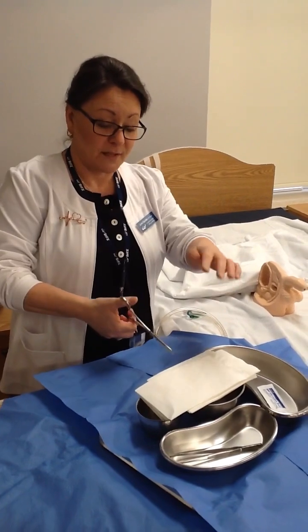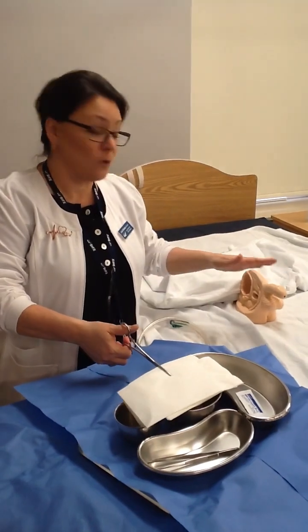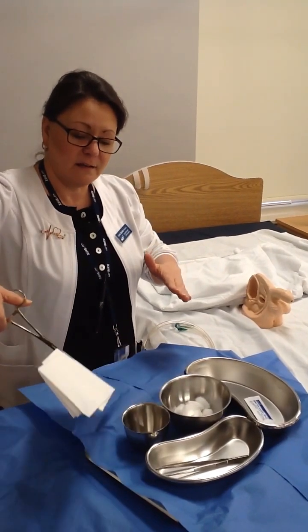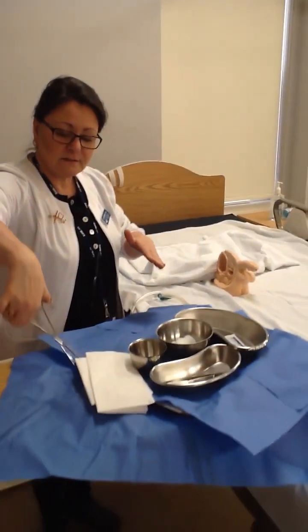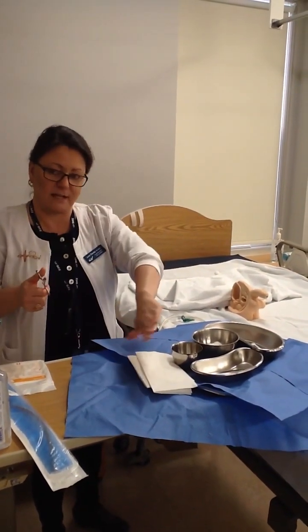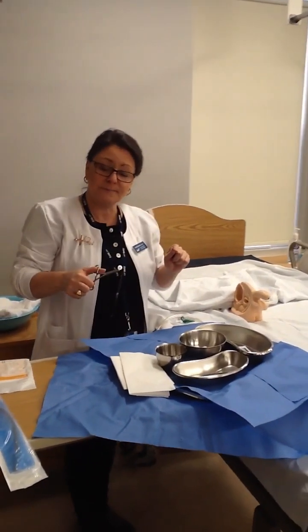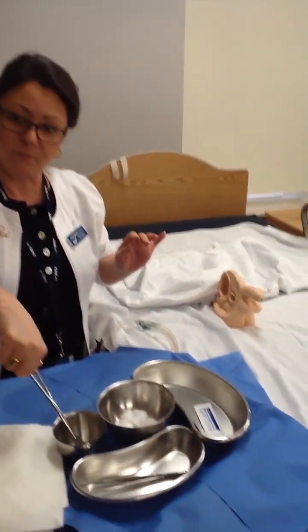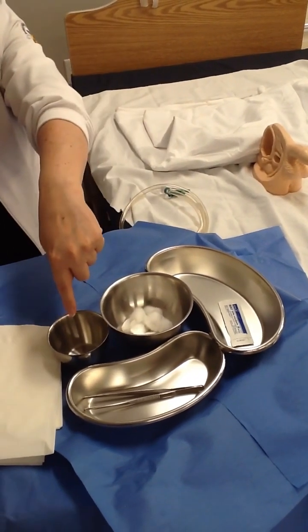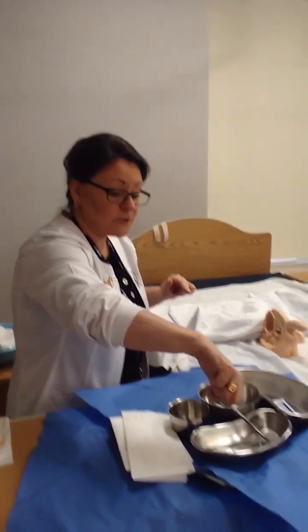I have a set of drapes, 2 of them, to create a second sterile field over here under my genitalia. Once I have everything set up here, I'm going to move that to the side, but well within my sterile field. So important that you don't let anything come outside into that 1-inch unsterile border. So you can see that snugged in there and it's safe. You can see I have a third bowl inside here with my cotton balls. And you can see this smaller sterile bowl, that's for my sterile water. So my cleansing solution will cover the cotton balls, and I need 10 mils of sterile water in this procedure to inflate my balloon. And then I have a pair of forceps. Okay?